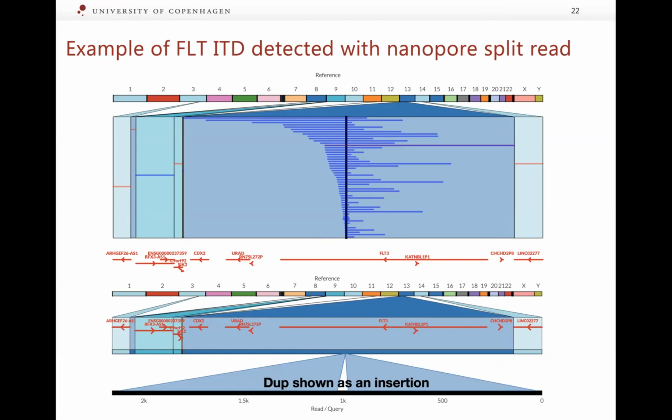So that's an example of using nanopore sequencing, which is obviously interesting, but also clinically highly relevant to use in the diagnostics of this FLT3 sample. The clinicians kept on telling us, we need to find FLT3. We just need it for our algorithm to prognosticate the patients.